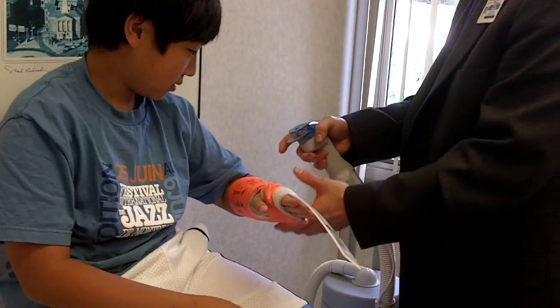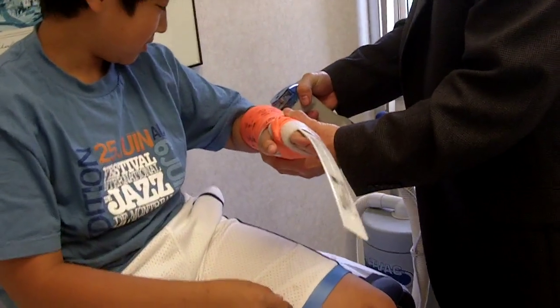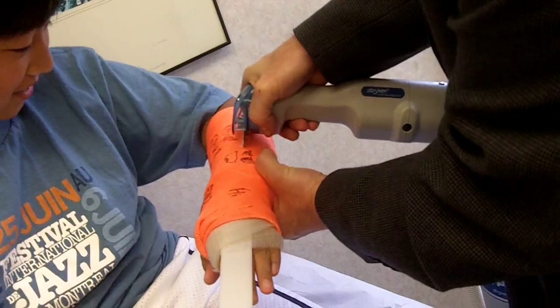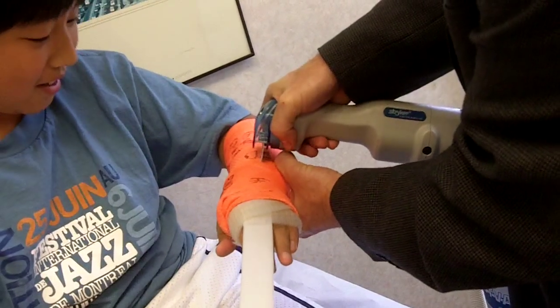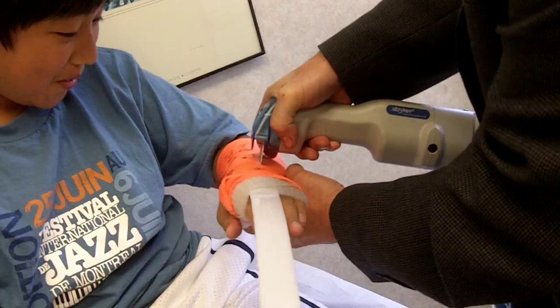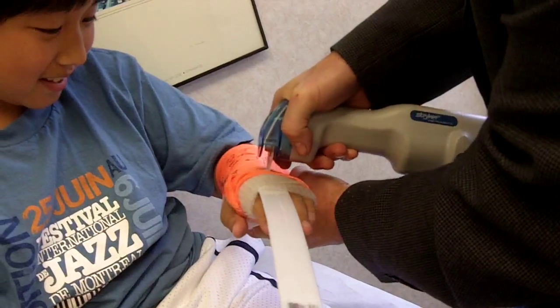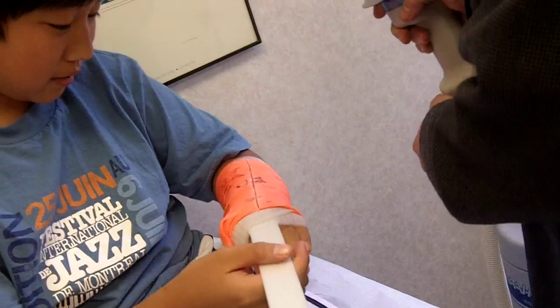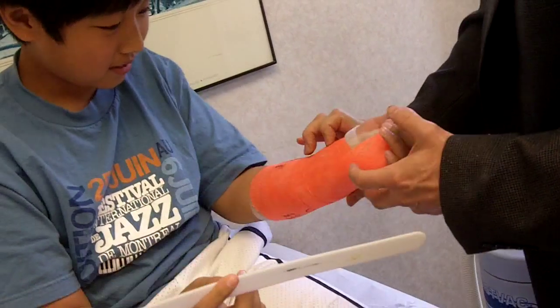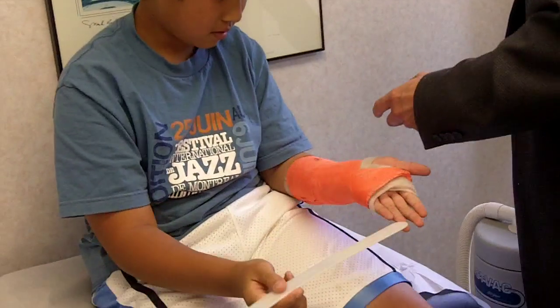I'm going to touch this one. Like 10 to 10 right now. Pull that out. I think I'll do the other side now. Yeah, that's probably good. I'll just do it like this.